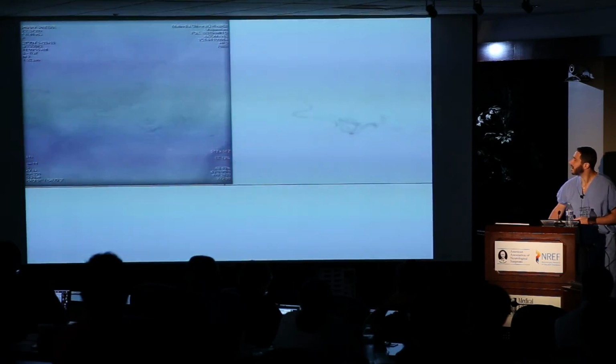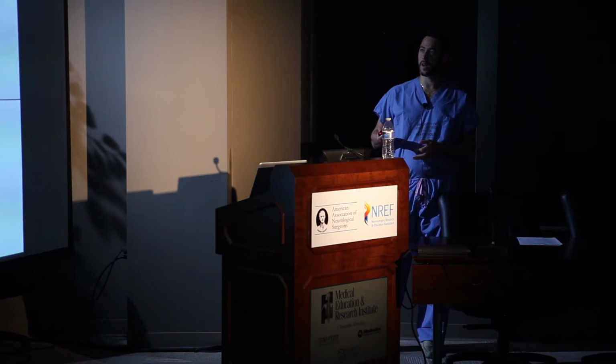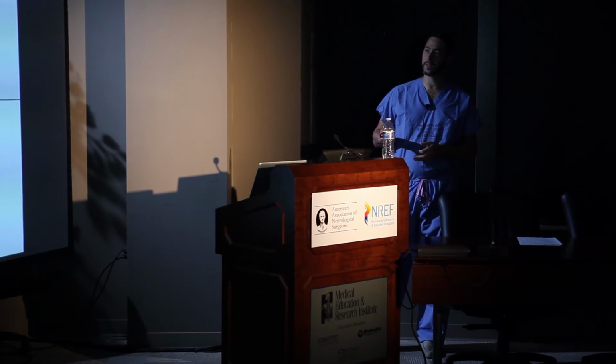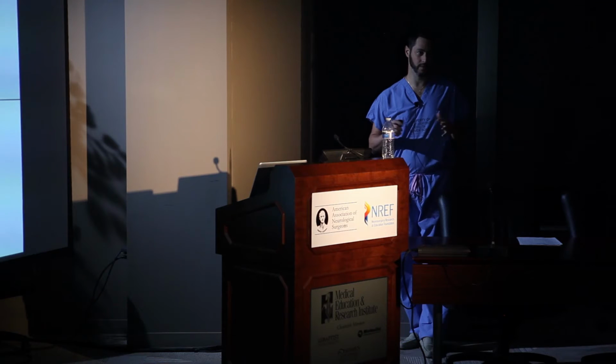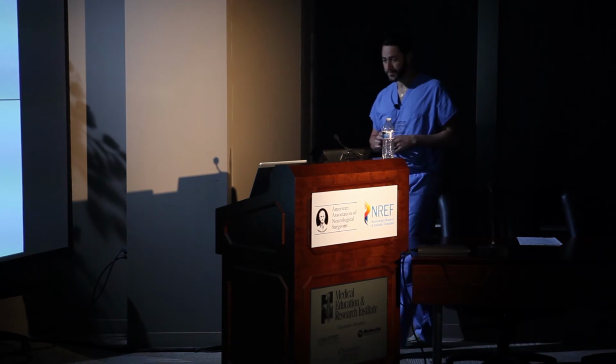So, at the end of the day, it's still injecting glue from that location, a little bit more diluted. And I feel like I filled up the nidus. Some stuff leaked into the vein, which is kind of what I wanted. I wasn't sure that I'd be able to cure this, but I have a very low threshold for the OR, as we've all discussed. You need to be confident. It's a ruptured AVM. You want to know that it's going to be cured.